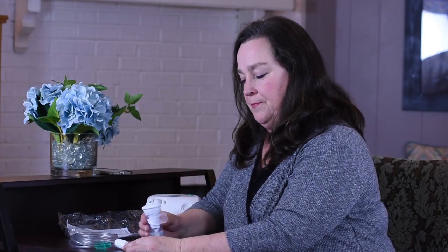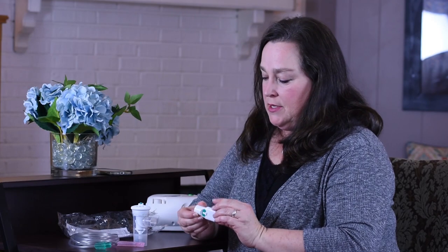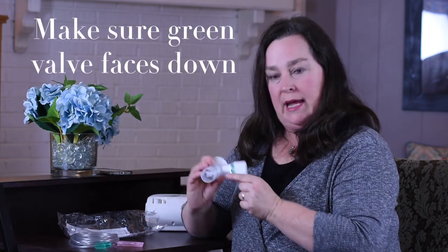Next, we would assemble the mouthpiece. You will notice there is a green valve on the bottom side of the mouthpiece. As you assemble the mouthpiece into the nebulizer cup, make sure that the valve is facing down.